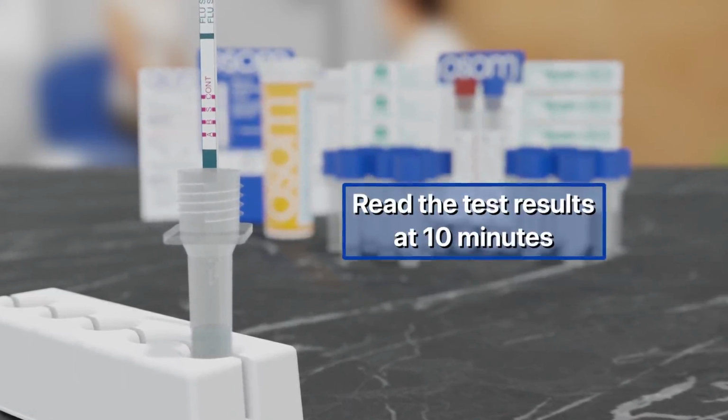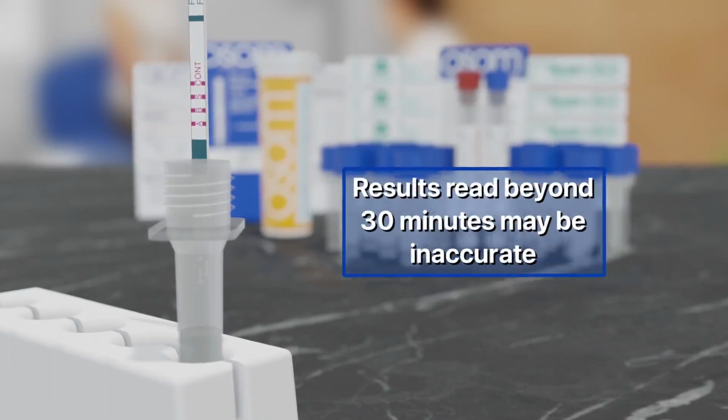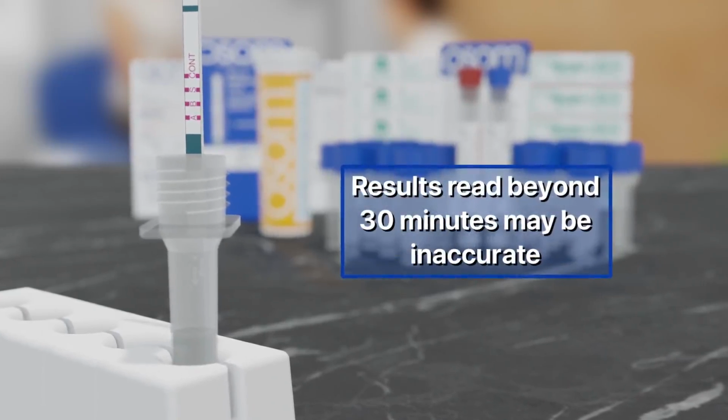Read the test results at 10 minutes. Do not read the test results before 10 minutes or after 30 minutes. Note: you may need to remove the test stick to read the test results.